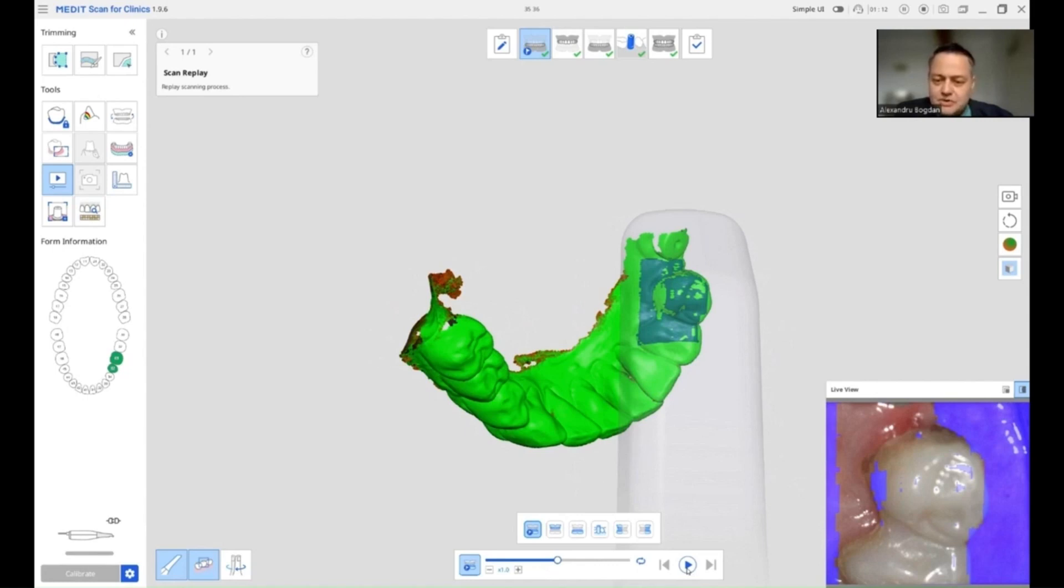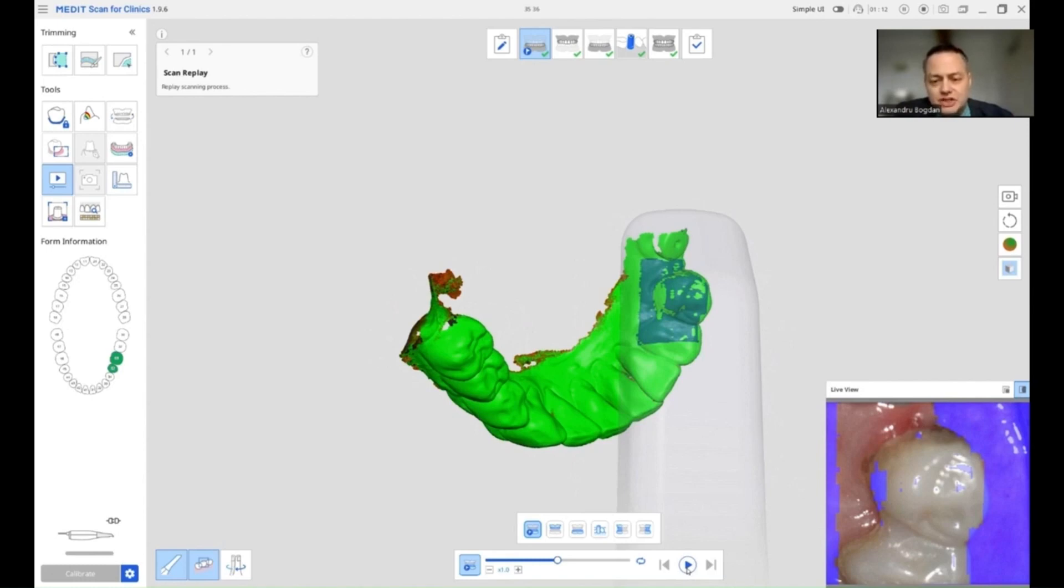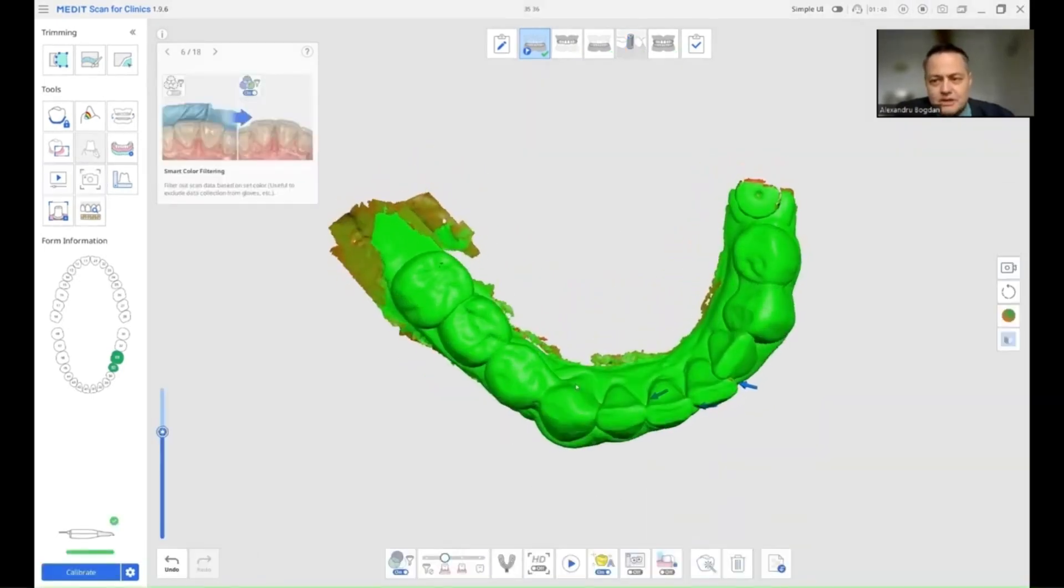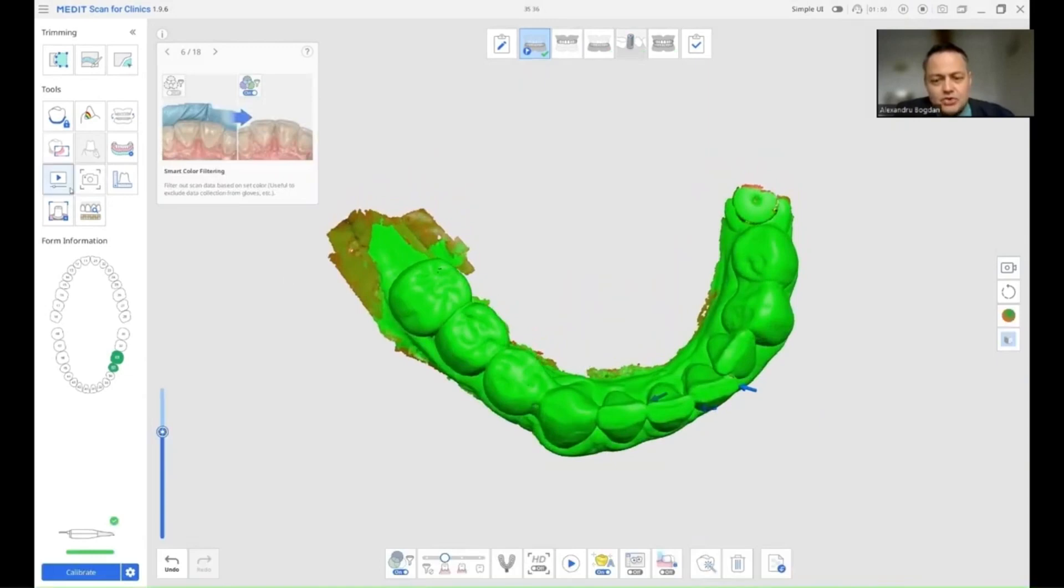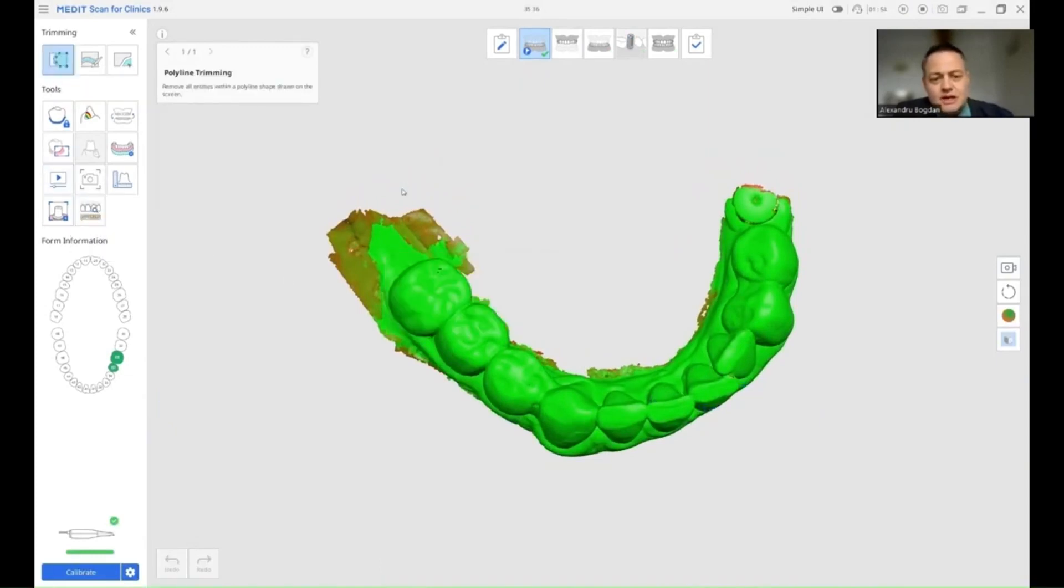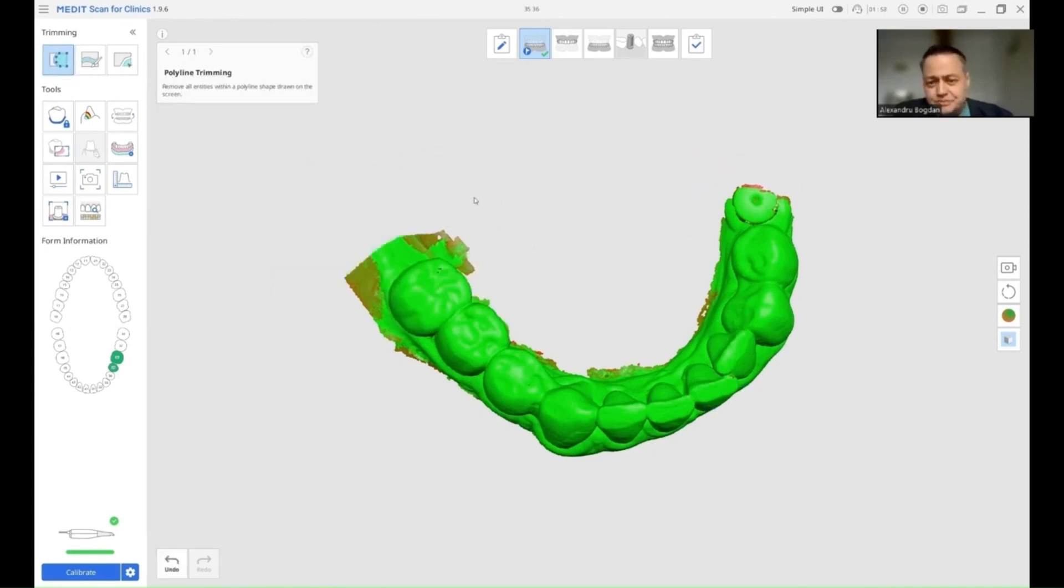As you can see, I am completing the last pieces of the scan and I am going to stop here. I am not going to take an impression of the healing abutments yet. I am going to check my scan and trim any unnecessary data as you can see in the next image.